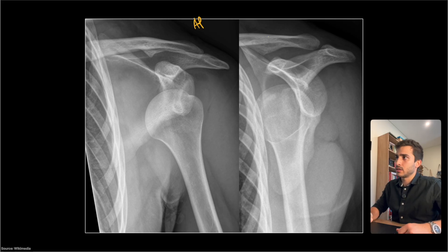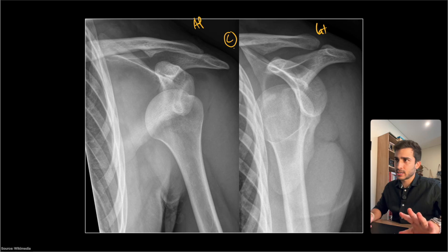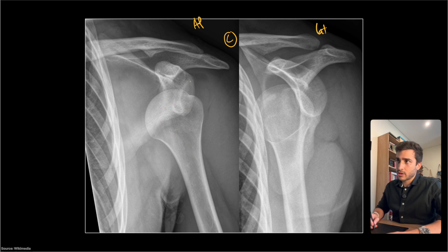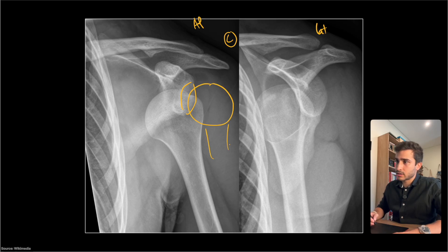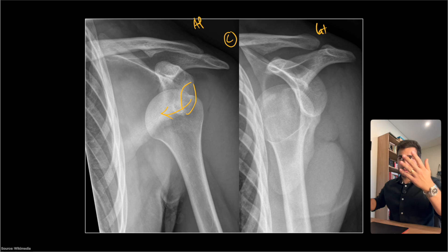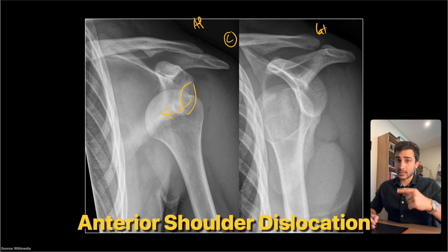Case four — we have an AP and a lateral of the left shoulder. Just focusing on the AP, the humeral head looks like a Q. You can also easily see that it's dislodged from the glenoid fossa — the humeral head ideally should be seated there, but it's migrated away. This location looks like an externally rotated shoulder; with abduction and external rotation, it looks like it's been pushed forward. So it's an anterior shoulder dislocation.